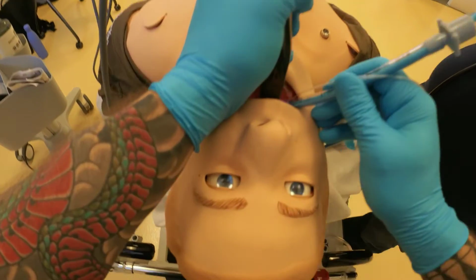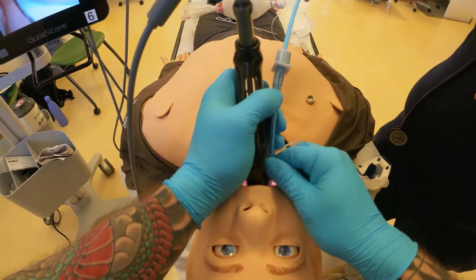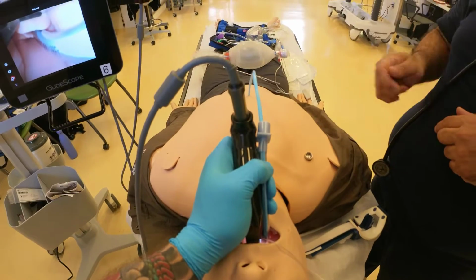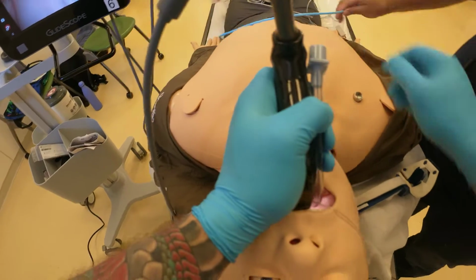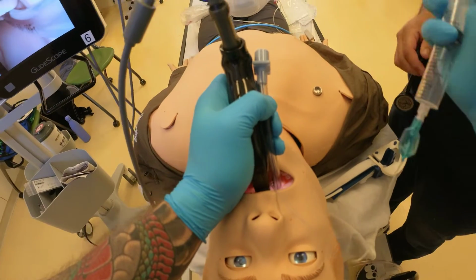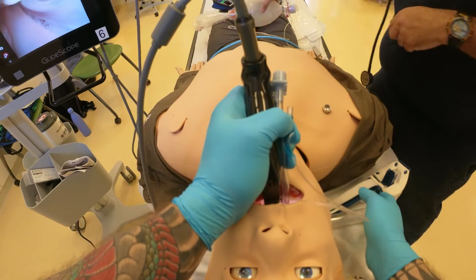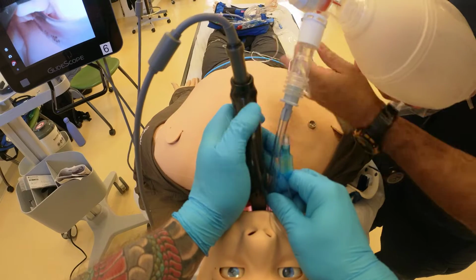Again, I know that I am at 20 at the lips, right? Put it in my hands, and then what we do is towards the feet, we'll remove it slowly, right? So you guys can see, towards the feet. Inflation of your balloon, right? And we take the BVM, and I see it's still positioned in the right place, right?